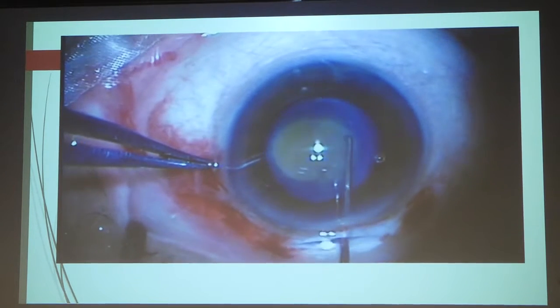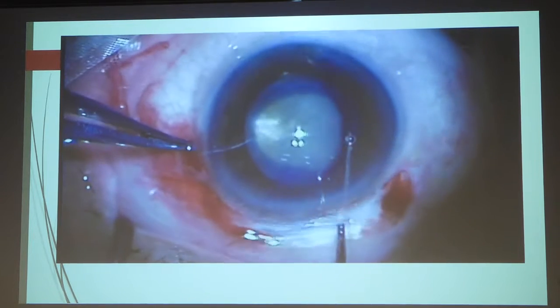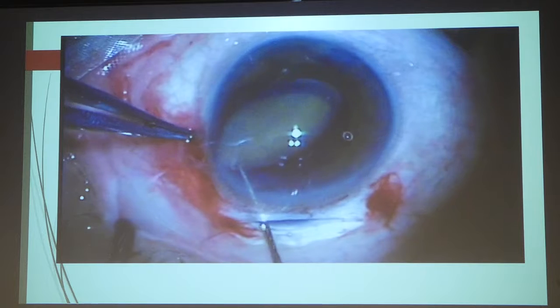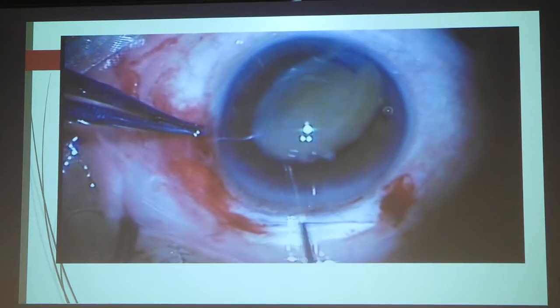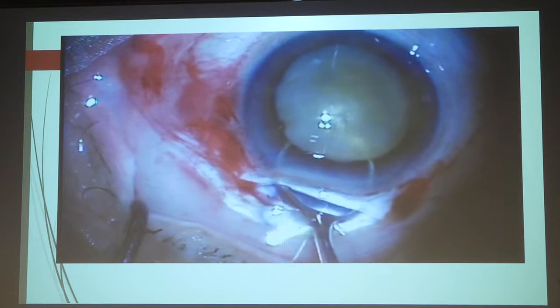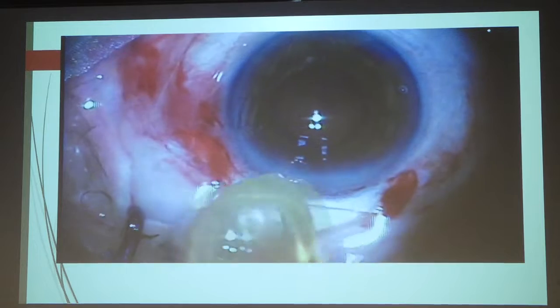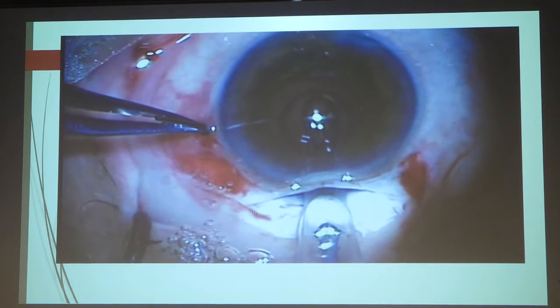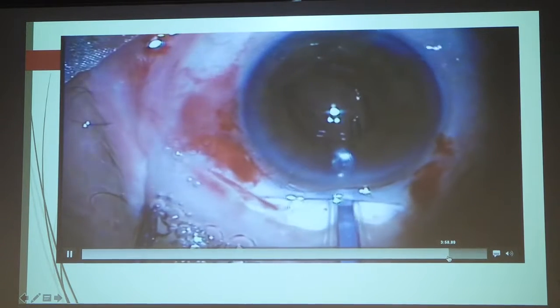Prolapse into the anterior chamber is performed using a Sinski hook. If the anterior chamber is shallow, the Sinski hook is kept parallel to the iris plane; if deep, it is kept vertical. Wire vectis is used for nucleus removal from the anterior chamber, avoiding any iris contact. Cortical matter is removed and a foldable IOL — including trifocal — is implanted through SICS, taking care of the steeper axis.